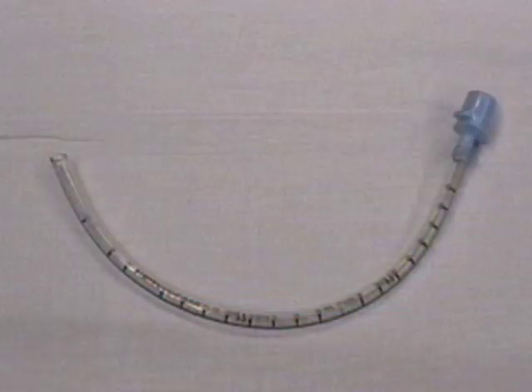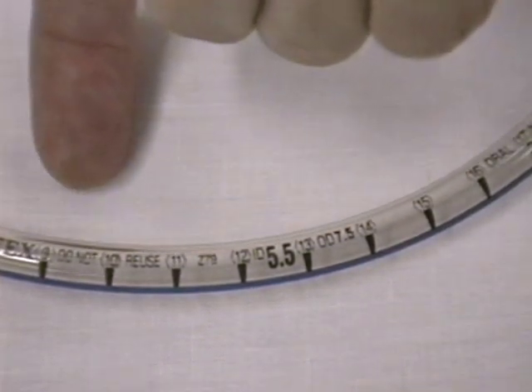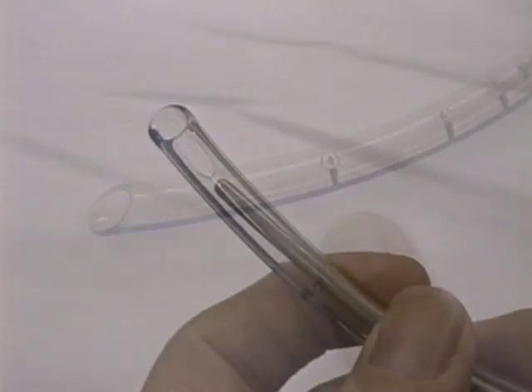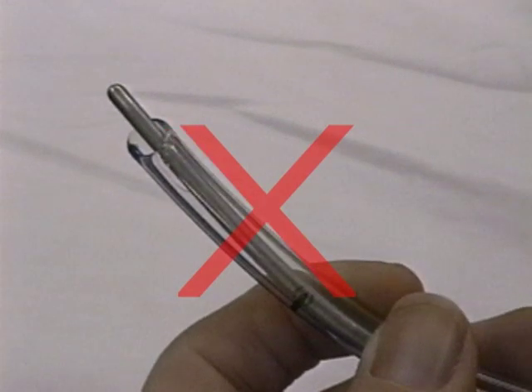Endotracheal tubes have depth markings in centimeters. Insert an uncuffed tube until the lowest, most prominent mark is level with the vocal cords. Insert cuffed tubes until the cuff just passes through the cords. Make sure your stylet, if you use one, does not extend beyond the tip or through the Murphy eye where it could damage the trachea.